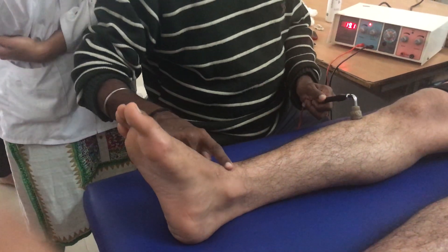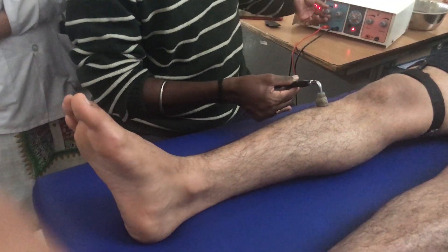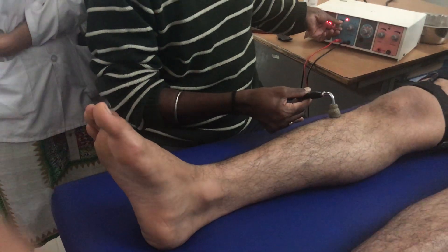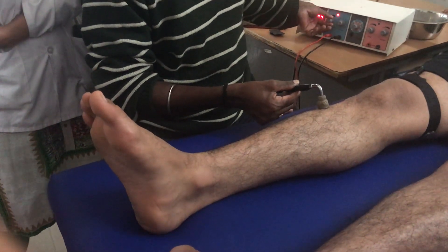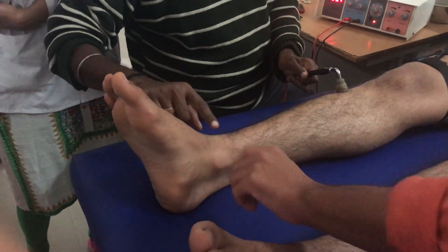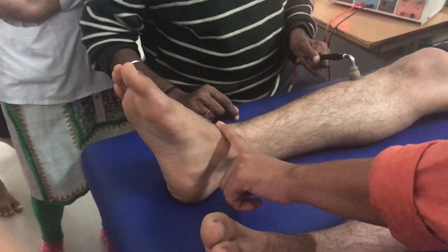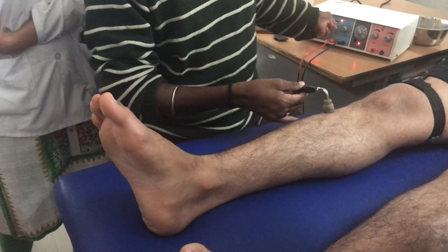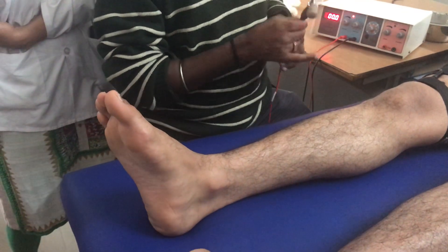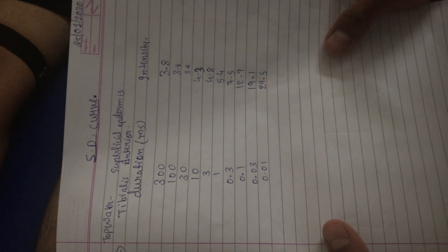As I reduce the duration, the intensity required to stimulate keeps increasing. Increasing intensity — this is 29.5mA. With this I am stopping. I have done all 10 durations and noted down the intensity for each one. That completes the procedure for plotting the strength-duration curve.